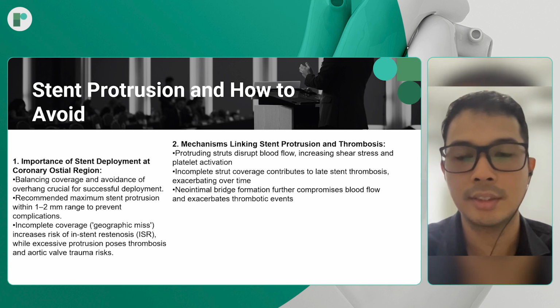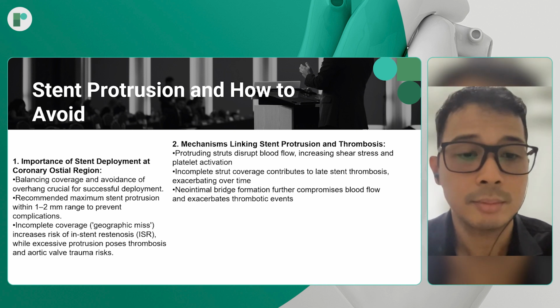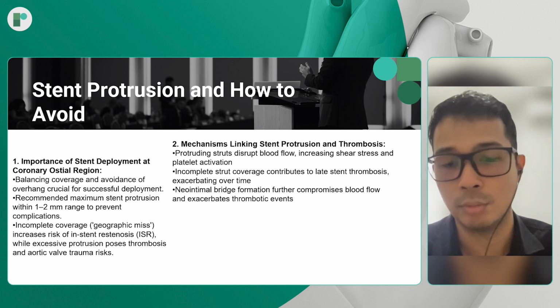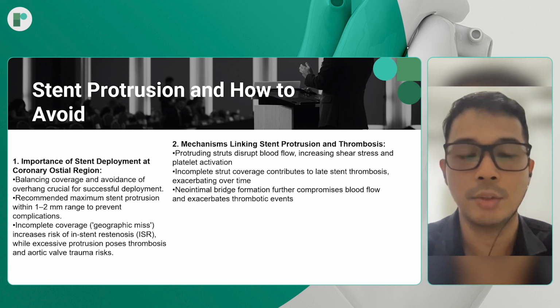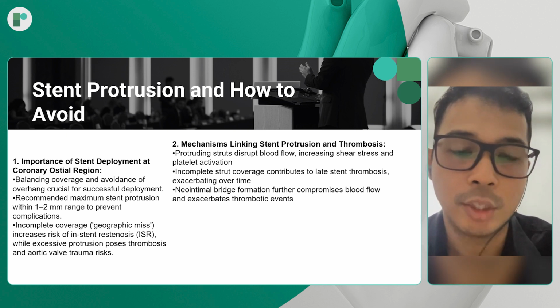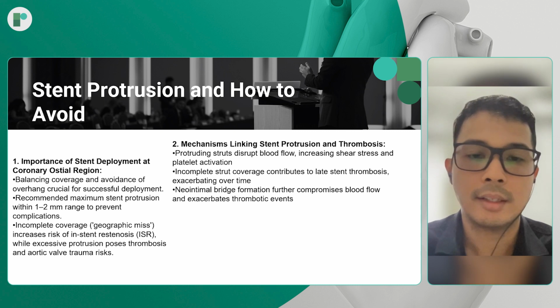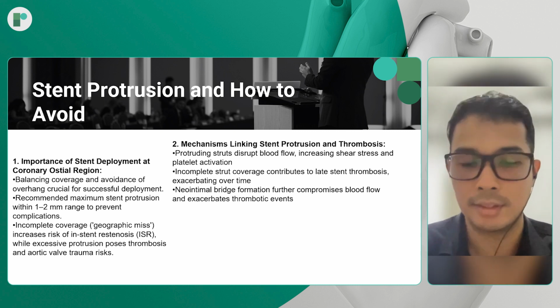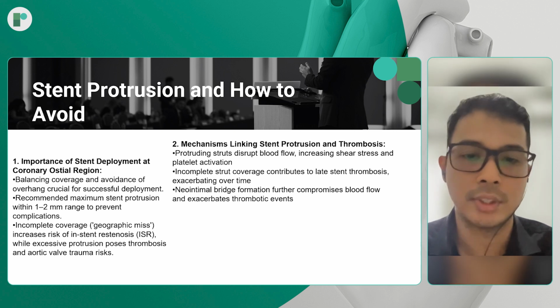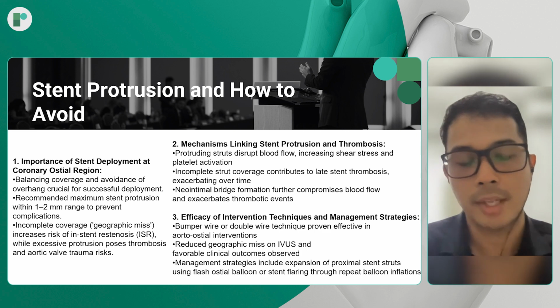In this patient, the previous PCI was around 10 years ago, but fortunately, there was no significant complication like thrombosis or in-stent restenosis. Although we might see in the first procedure the ostial pressure damping, fortunately, we can tackle the problem with specific techniques and devices. Furthermore, neointimal formation further compromises blood flow and exacerbates thrombotic events.